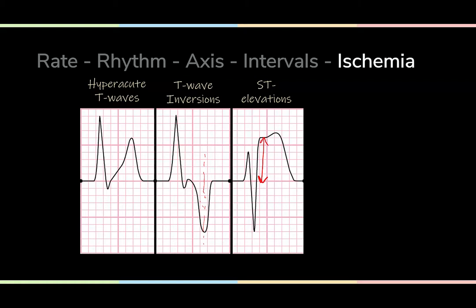And we tend to compare the ST elevation against the baseline, which we define as the TP segment. There are some other ways to measure ST segments, but for the purposes of this curriculum, we're going to consider the TP segment our baseline.